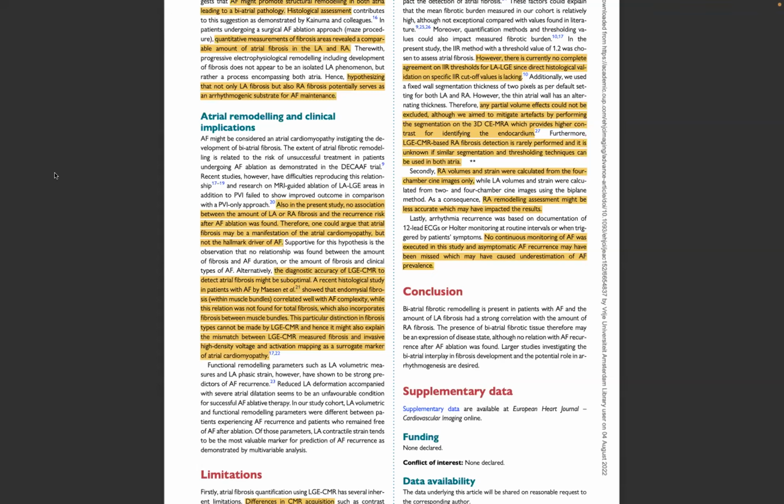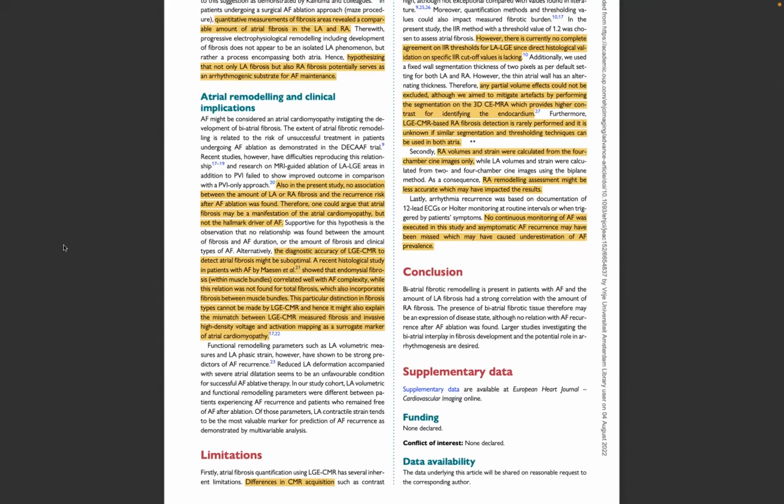Well, first, thank you for the invitation for presenting our article in this journal club. And yes, indeed, what Julia said is that we used the MRA to segment the left and right atrium, so we hope to stick to the atrial wall as much as possible to get a good segmentation. But indeed, it is difficult, and the atrial wall is thin, and the thickness of the atrial wall is variable across the atrium. So we used a 2-pixel wall thickness, which is not always optimal, I think.